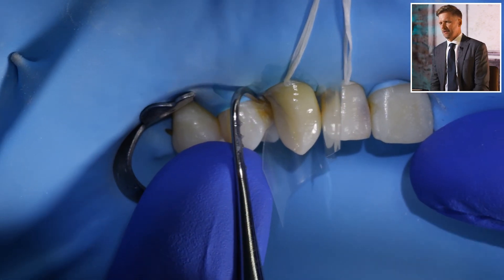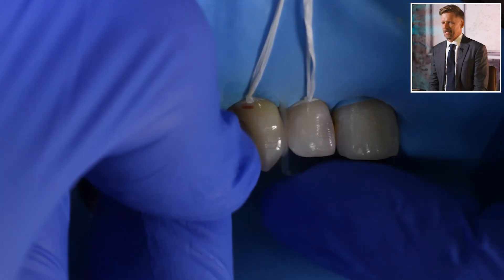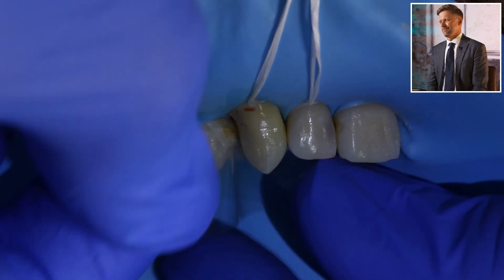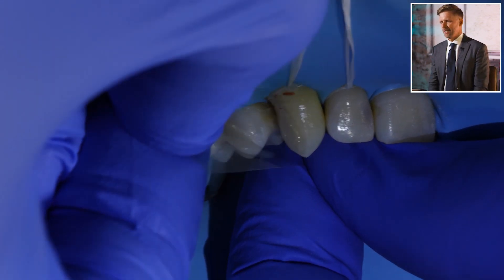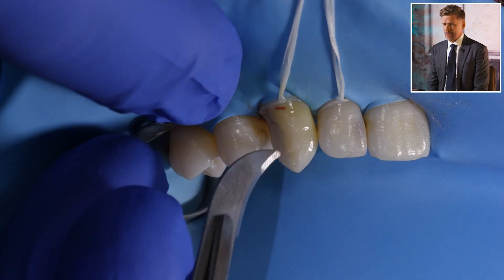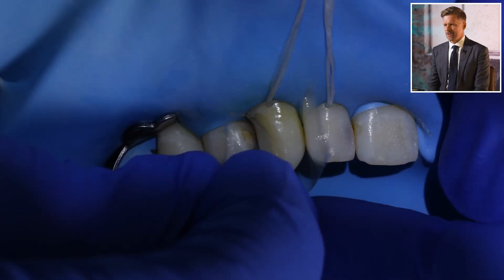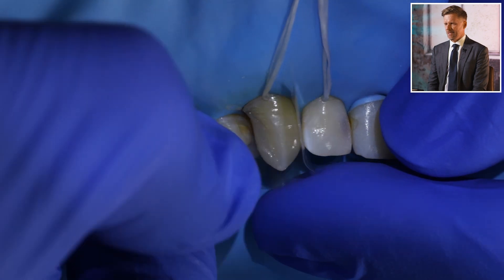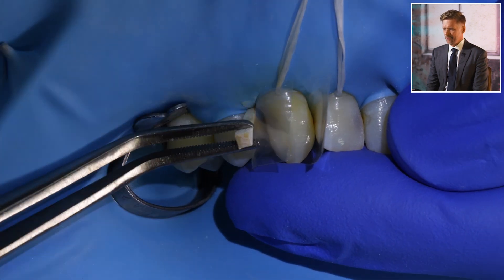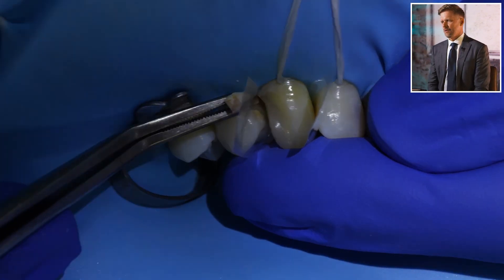I'll put the matrix on the mesial first since that's the tight contact. There's some blood here — this kind of thing makes new dentists freak out because at dental school you're not really taught that you can refresh the bonding. I've got a little resin joining the two teeth, so I need to pick that out before I can get the matrix through that tight mesial contact. Once it's wrapped around the tooth and held in place, I'll use the same wedge as before, wedging it against that little hip.